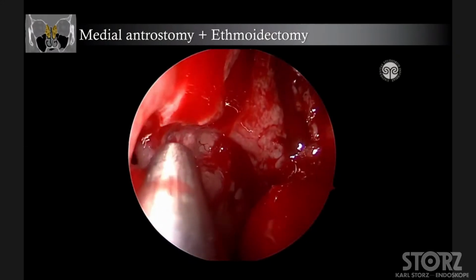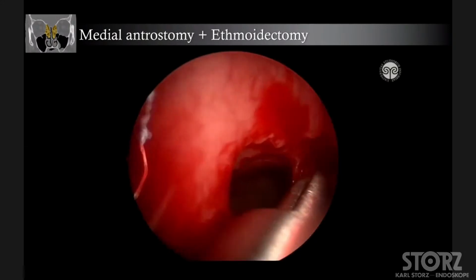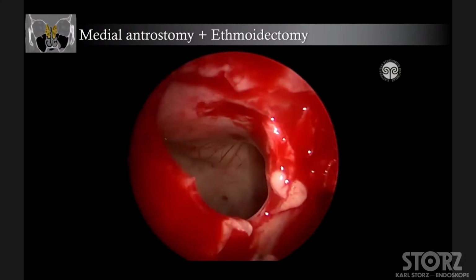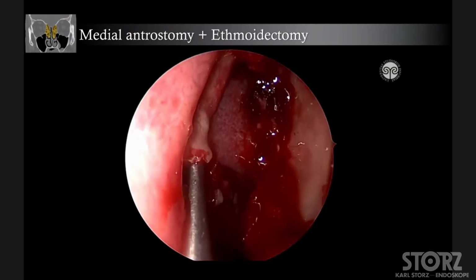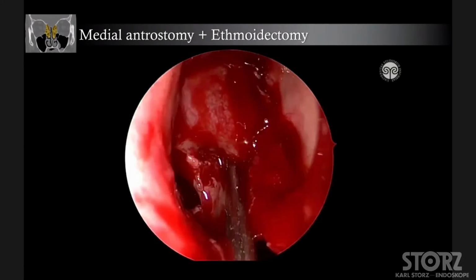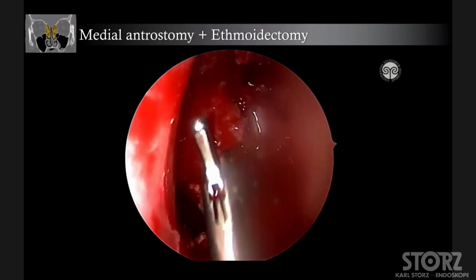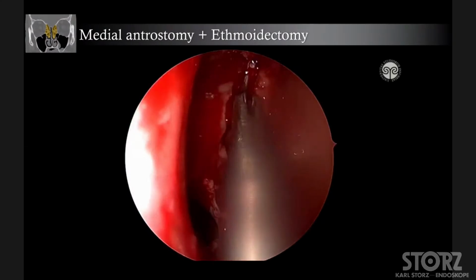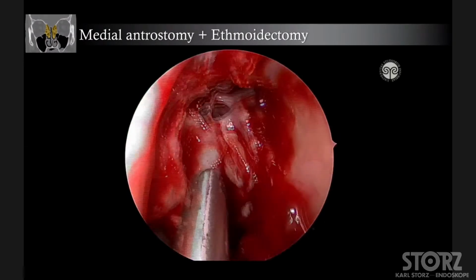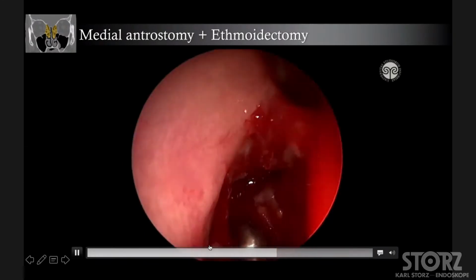Uncinectomy, identification of the natural ostium of the maxillary sinus, Stamberger forceps in order to calibrate the ostium, complete removal of the uncinate process, removal of the bulla ethmoidalis starting from the inframedial angle of the bulla ethmoidalis, cleaning of the anterior ethmoid completely in order to expose the second portion of the middle turbinate.